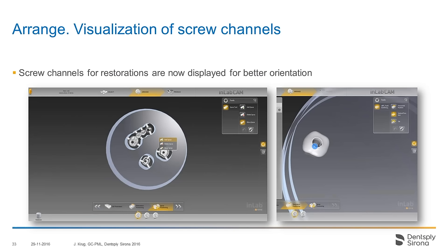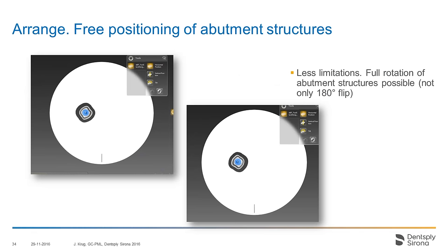Now stepping over to the arrange phase. There are some minor changes: the screw holes will now be displayed in the restoration for better orientation — for some abutments this was not the case in the past, so this gives a little better orientation when you want to position implant-based restorations in a puck. Also, there are fewer limitations in terms of positioning or rotation of abutments: today it's only possible to flip them by 180 degrees, but in the future there is more freedom to rotate these restorations.